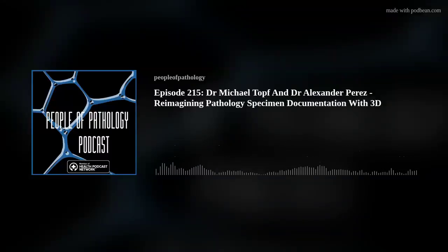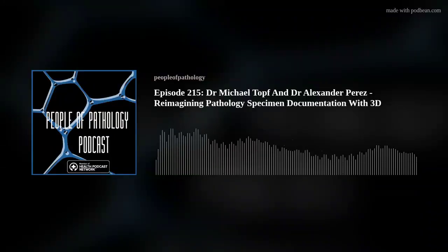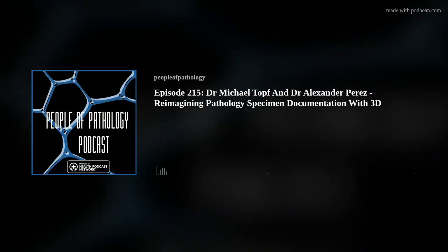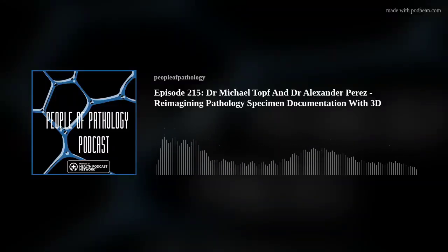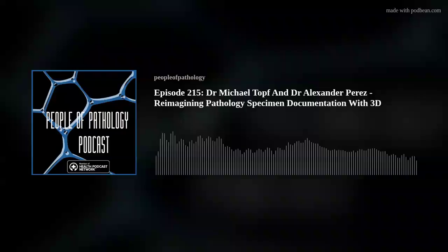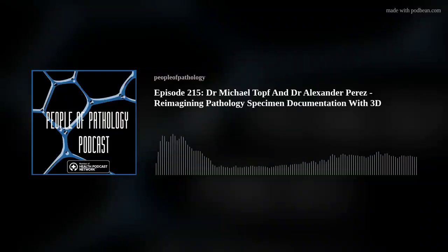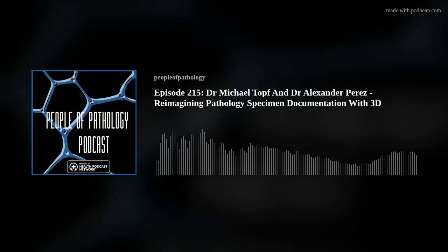Okay, that makes sense. So what about the cut surface after the specimen is sectioned? Are you taking photographs of that? Because we know that depth of invasion is often really important. Yeah, that's something that we're working into now, is what to do about cut surfaces. Because so far, for most of the specimens we've been doing, the section starts from the surface anyway. It involves the surface. So when you're mapping this, you just show it as if it's going into the model, but then they'll take separate 2D photographs of cut surfaces still for that purpose.